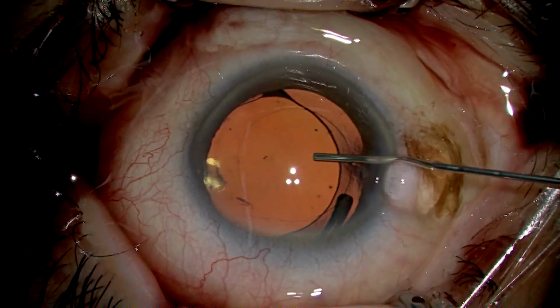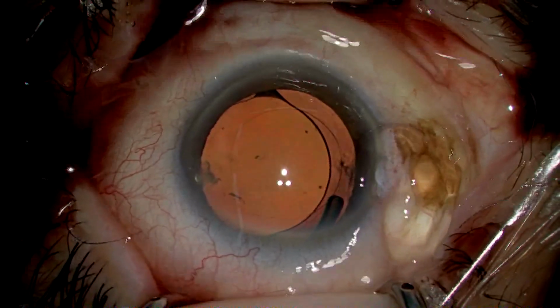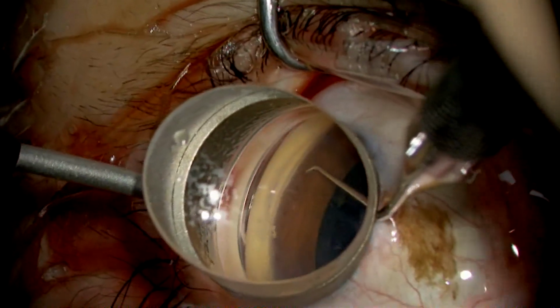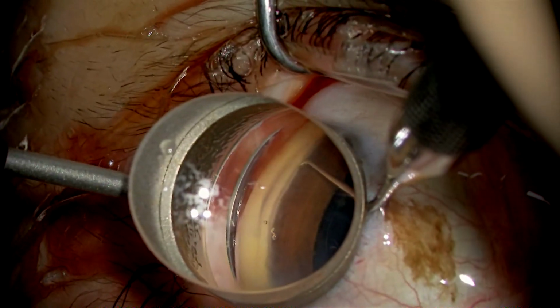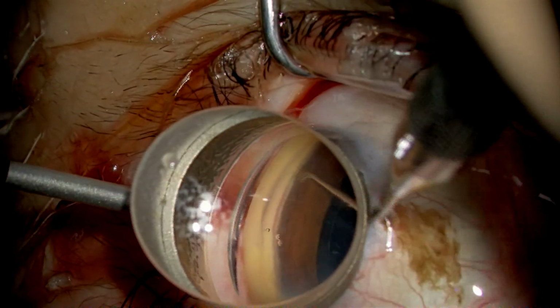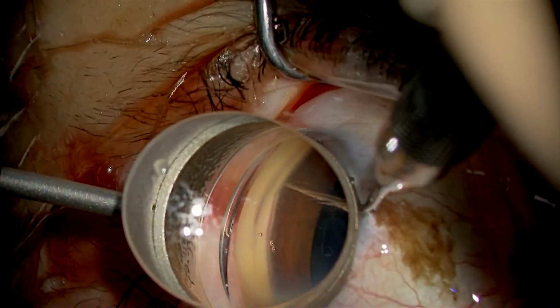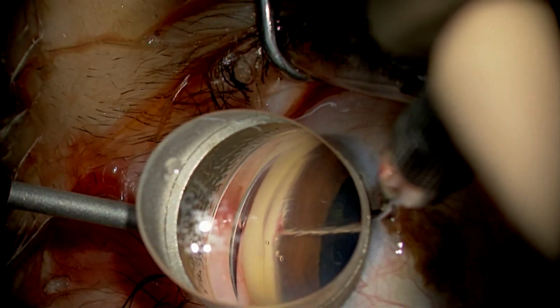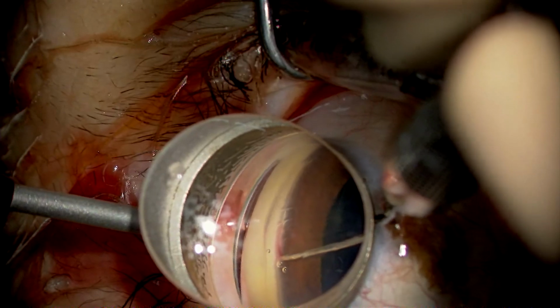This shows how the TMH is used in this surgical technique. After injecting OVD into the anterior chamber to stabilize, with a gonioprism lens to observe the temporal angle, the tip of the micro-hook is inserted directly into the Schlemm's canal and moved circumferentially to incise the inner wall of the Schlemm's canal and trabecular meshwork.